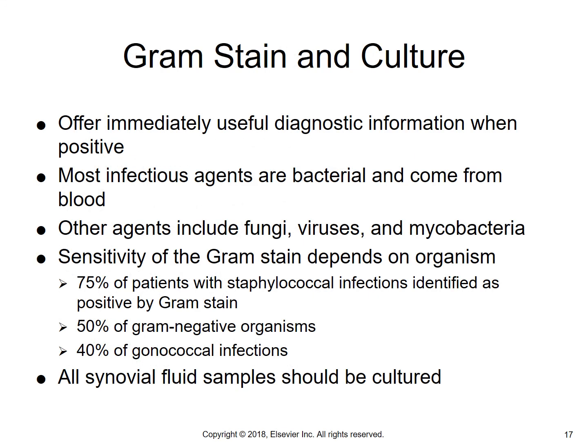All synovial fluids should be cultured to determine if there is any kind of infectious agent causing this effusion. A lot of the time the agent can be identified using a Gram stain because they're mostly bacterial in nature.